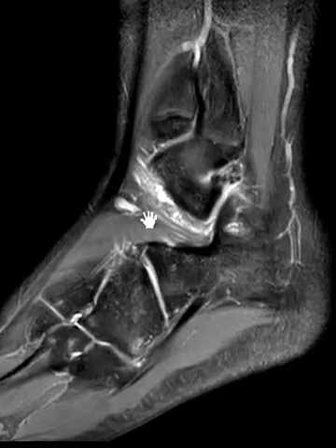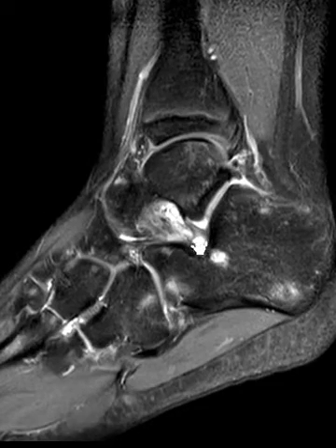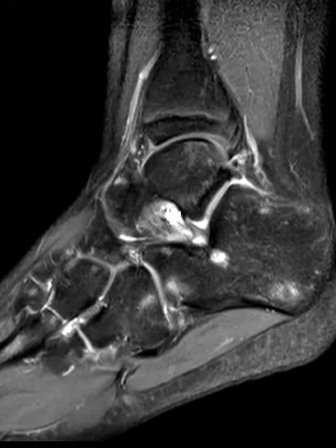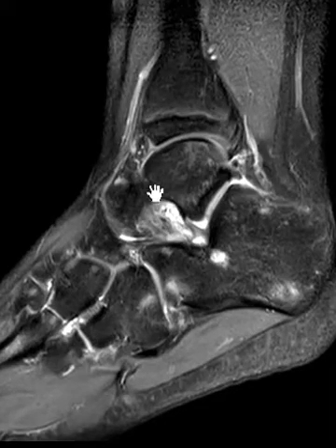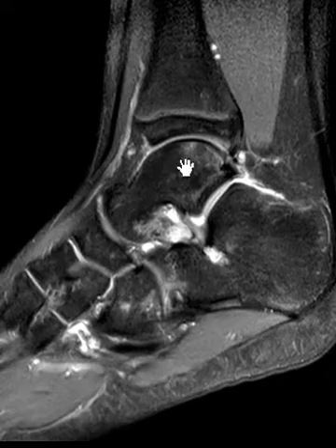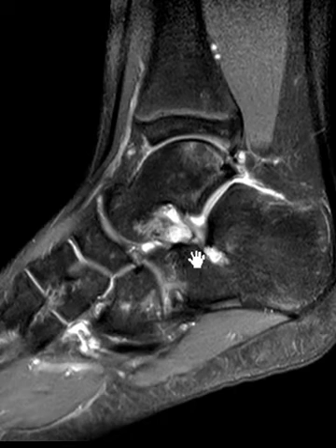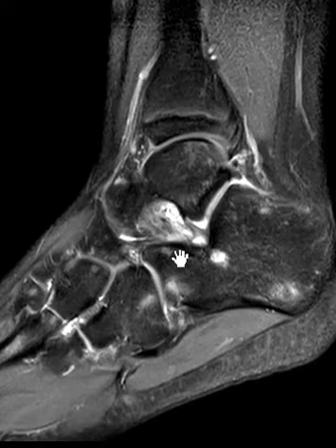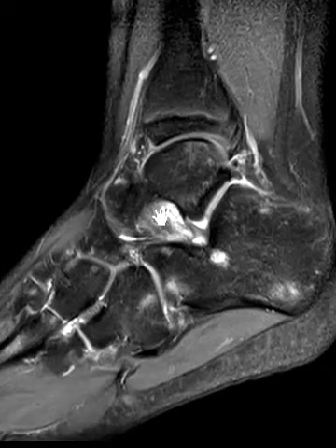Moving to the next component toward the central sinus tarsi, we see a ligament coming off the inferior calcaneus obliquely forward to the cupped portion of the talus — this is called the cervical ligament, named for the neck of the talus. Right where it comes off the calcaneus, you can see it is stripped up slightly. One slice over, there's a fluid signal area — indicating a tear through the cervical ligament at its base.